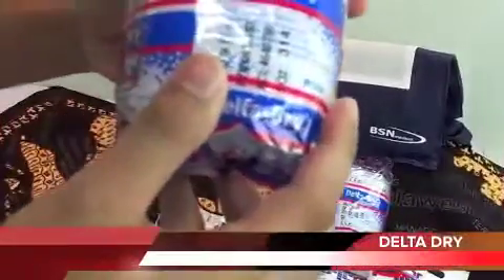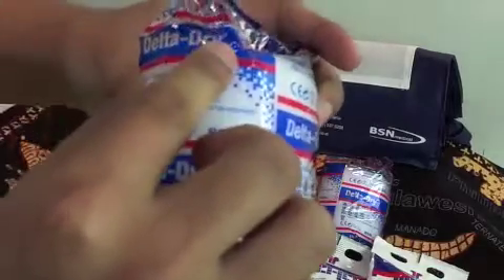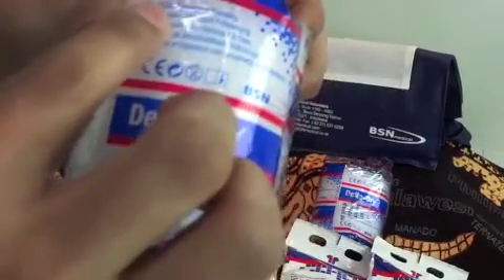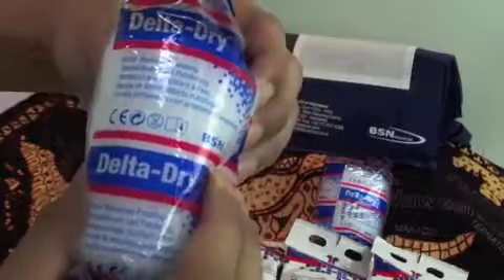To create a waterproof cast, we have to use a synthetic waterproof padding. We use Delta-Dry, which is made of synthetic material and is very soft, so it will not hurt the patient.